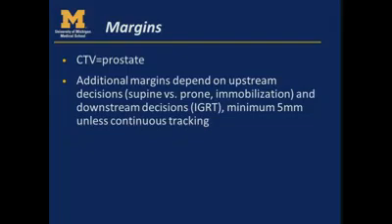So margins, similar side to everything. CTV equals the prostate actually for prostate cancer because there are usually multiple prostate cancers hiding within one person's prostate. So even though for research purposes sometimes people do whole prostate plus maybe a boost to a nodule, the whole prostate is still typically part of the target. And then the additional margins again just depend on any other decision that you've already made. So it's very important to have a really integrated system from start to finish.